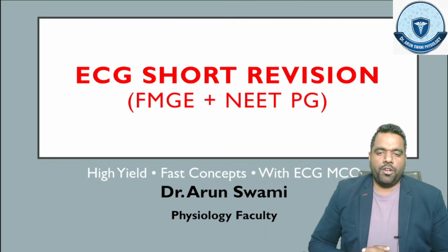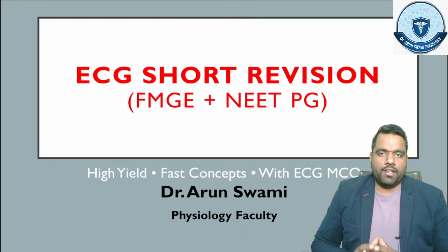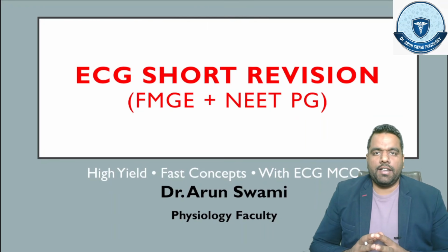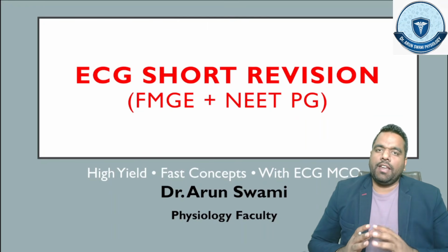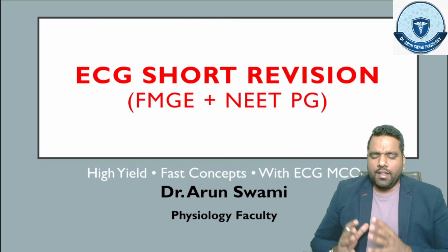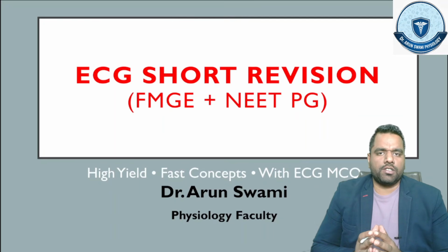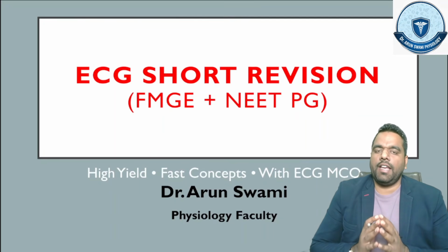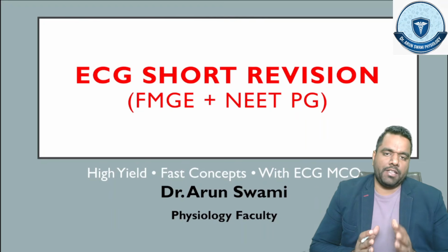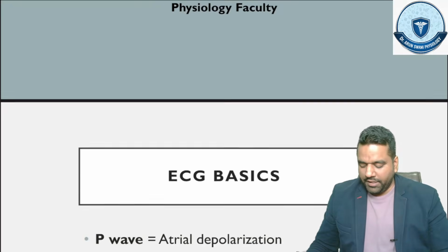So in this video we are going to talk about the ECG in a very short manner so that in your examination you can easily identify and answer all such questions related to the ECG. In this session we will discuss the high yield areas with fast concepts, ECG MCQs and image based questions, right guys? So let's start this ECG short revision.